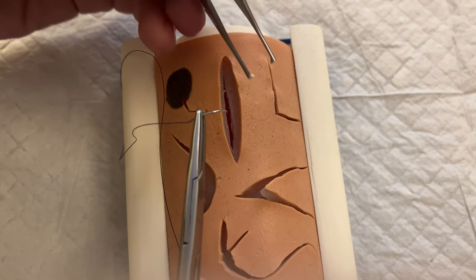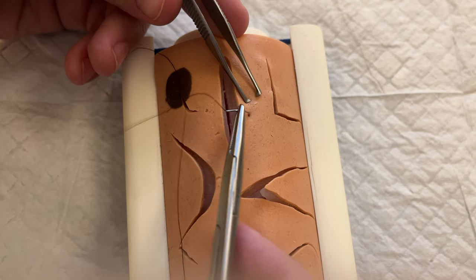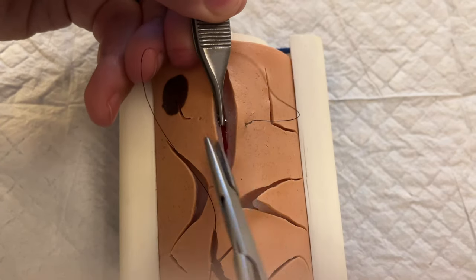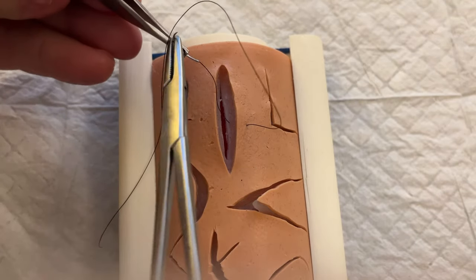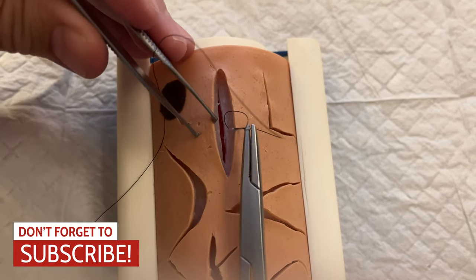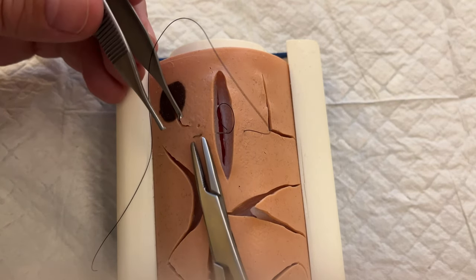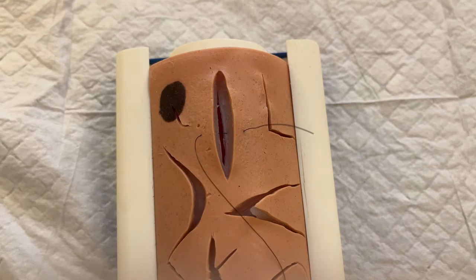Similar to a simple interrupted suture, we want to enter the skin about half a centimeter away from the skin edge, go down into the subcutaneous tissue, then reset and on the other side be at the same depth in the subcutaneous tissue at the same spot, and exit out of the skin just as we would with a simple interrupted suture.